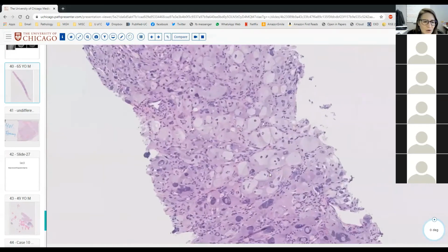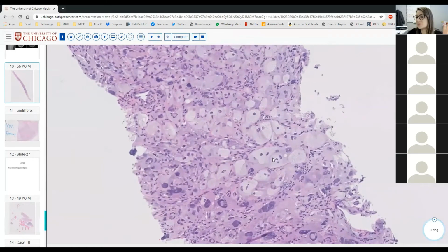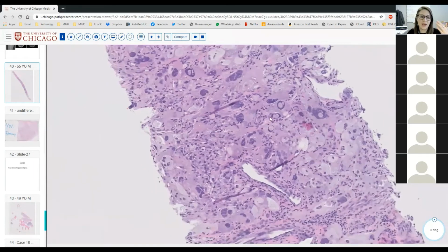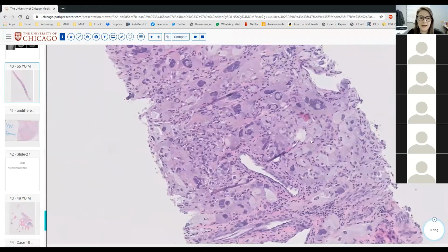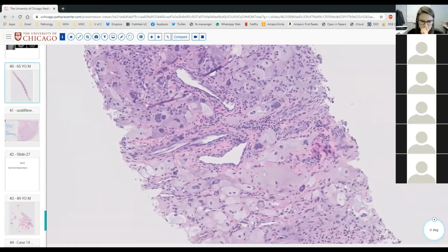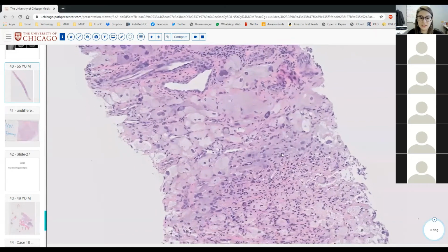So I think you can throw the book at this, the immunohistochemical book. Unfortunately, probably nothing is going to help you, but you have to exclude things like balloon cell melanoma, maybe some weird carcinoma, and S100 for lipoblasts. S100 doesn't necessarily stain the malignant liposarcomas. It'll stain benign fat, but it's not as reliable in pleomorphic liposarc or dedifferentiated liposarc. So I wouldn't use S100 alone if you're thinking liposarc.